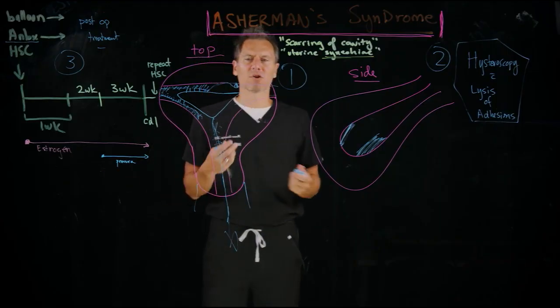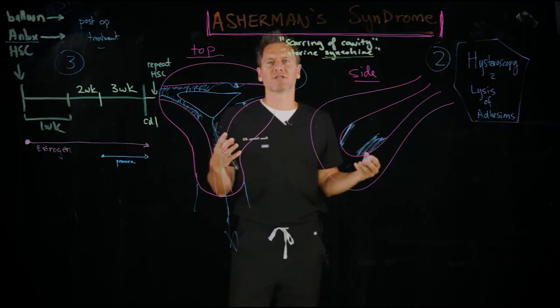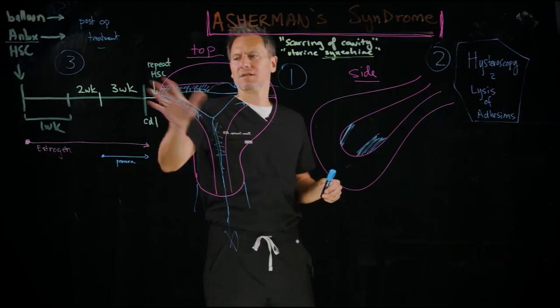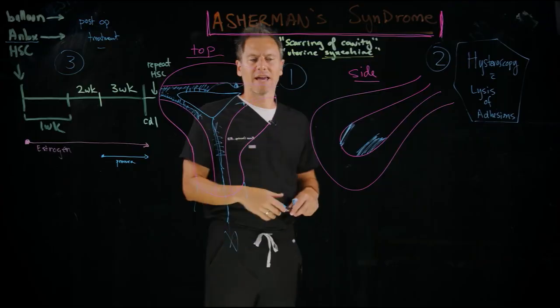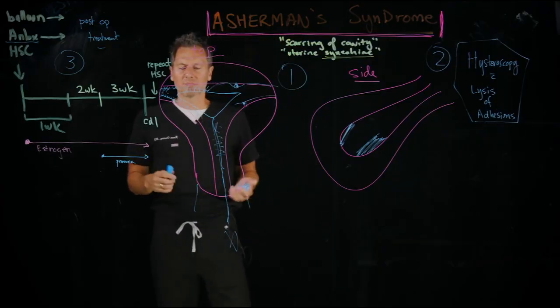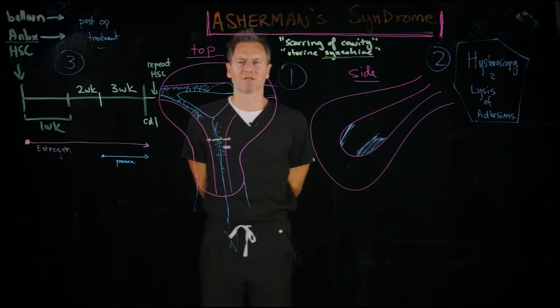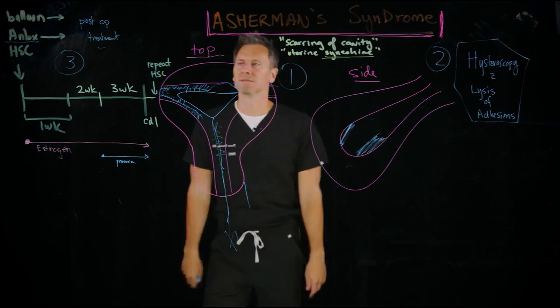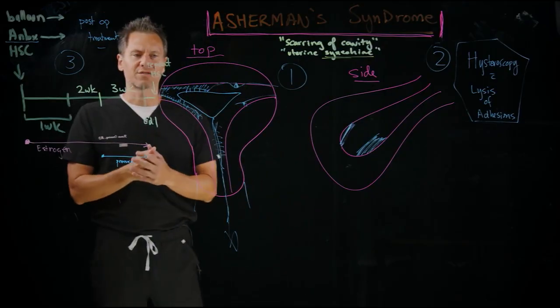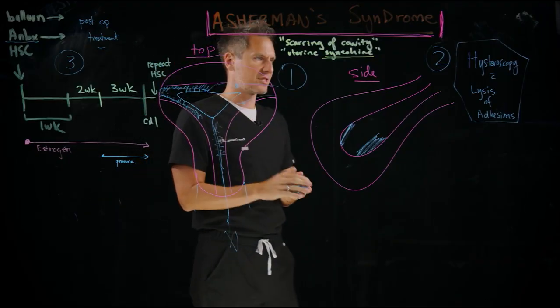Again, talk to your doctor. Everyone's approach is a little bit different. And again, it's a function of the significant diversity of severity that comes with Asherman syndrome, from just the very minor synechiae to the completely obliterated cavity. So keep in mind that there are lots of options available. It makes sense always to do hysteroscopy to understand and assess and treat. But at some point, there are limits to what can be corrected depending on the severity of the disease. Talk to your doctor, talk to many REIs who do a lot of complex hysteroscopy for this procedure.